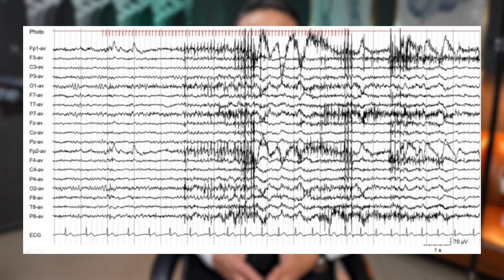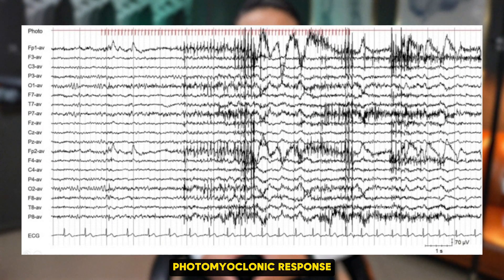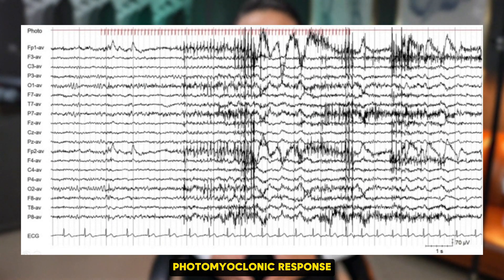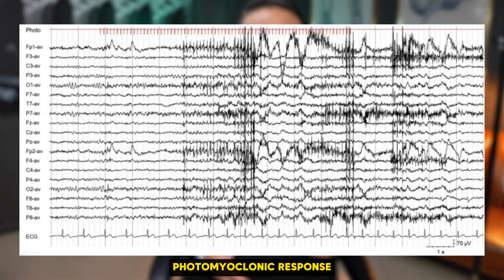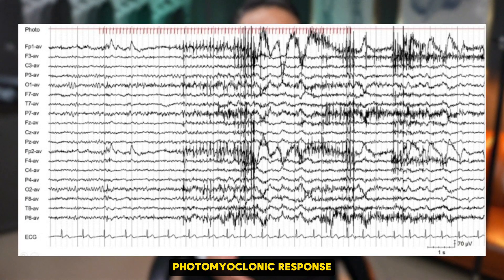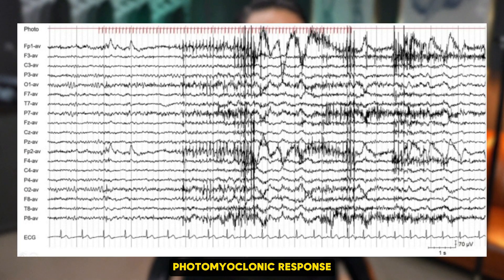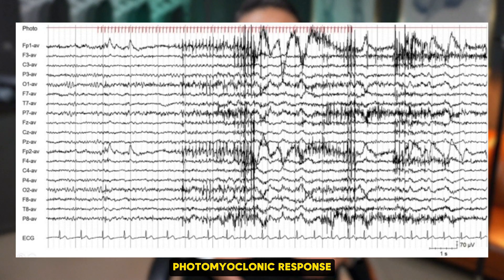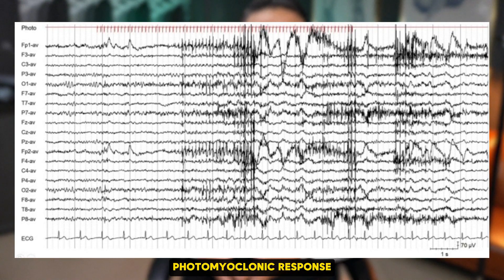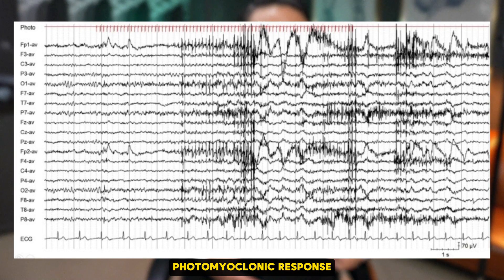Here you can see a clear depiction of a photomyoclonic response elicited during IPS. Notice how the myogenic spikes correspond to the timing of the light flashes yet maintain a slight delay — a hallmark of this response. This image is a perfect example of how these responses can appear during EEG monitoring.